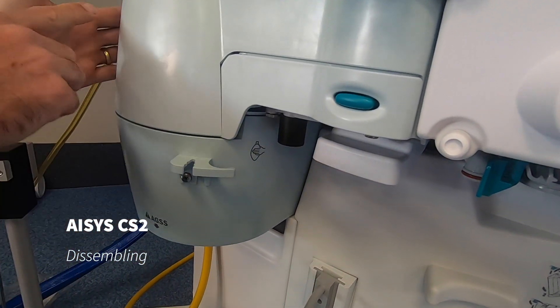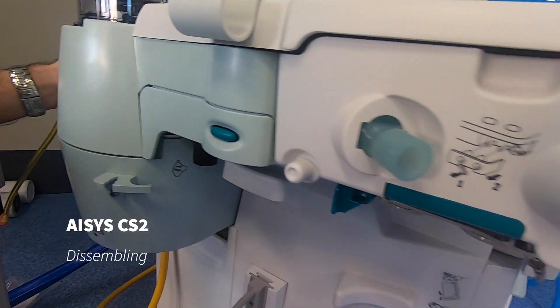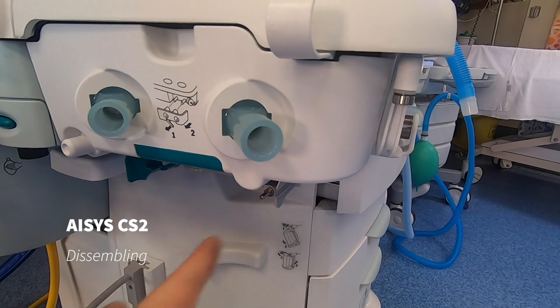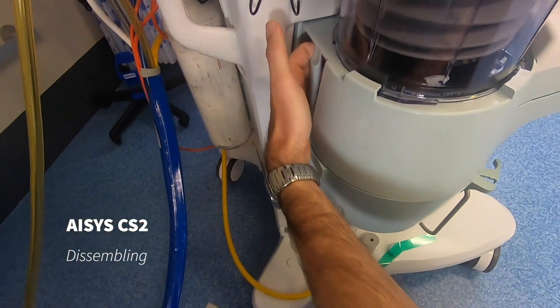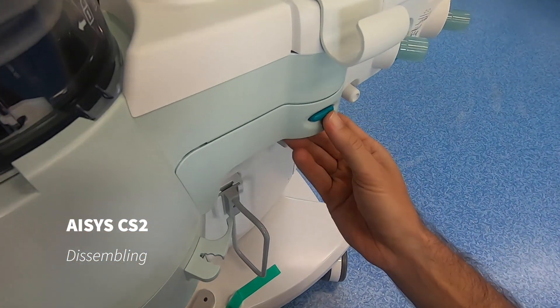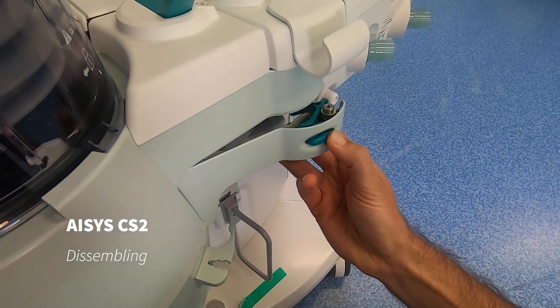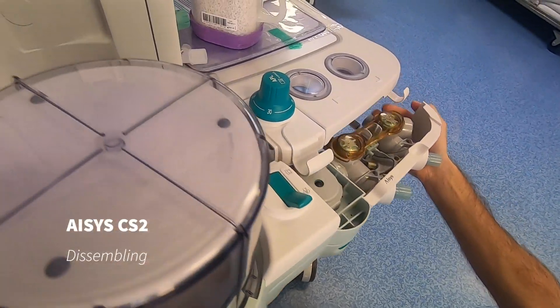The next step is we remove the breathing system from the back right to the very front. There's a handle on the back of the bellows here — hold on to that, press the green button in, and the lever comes out and the whole breathing system is removed.